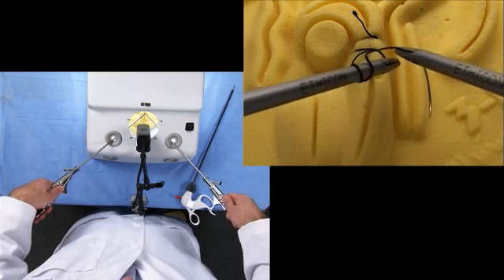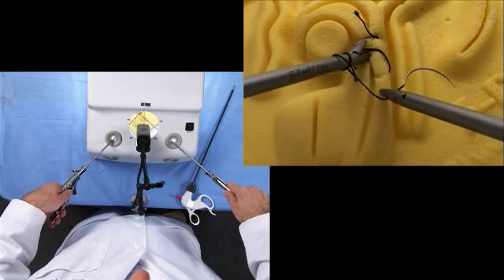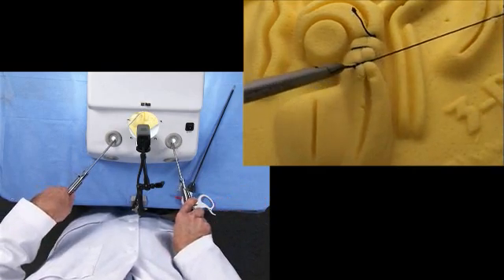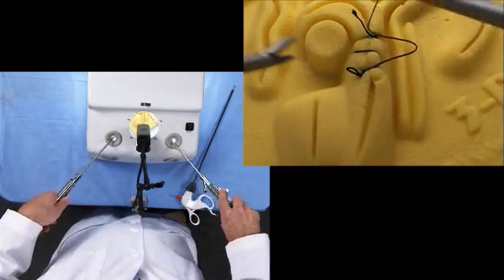Two wraps. Grasp the apex of the suture. We'll tie this down, change hands.